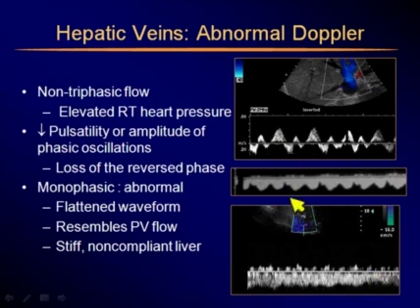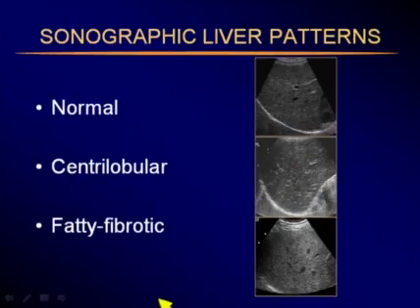So it should be a nice pulsatile pattern, and all of a sudden now it's flat flow. It's because the liver is stiff, the liver is non-compliant, and does not allow this wave to be reflected in the vessels. So now let's talk about sonographic liver patterns.